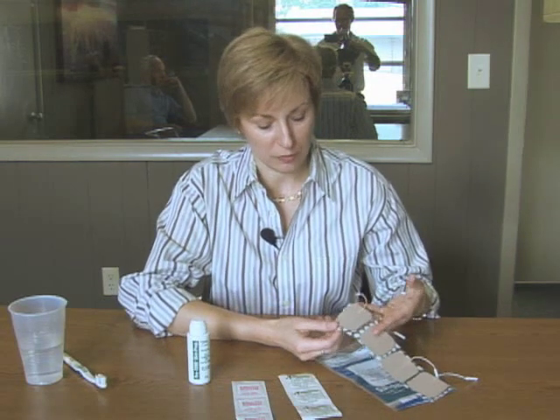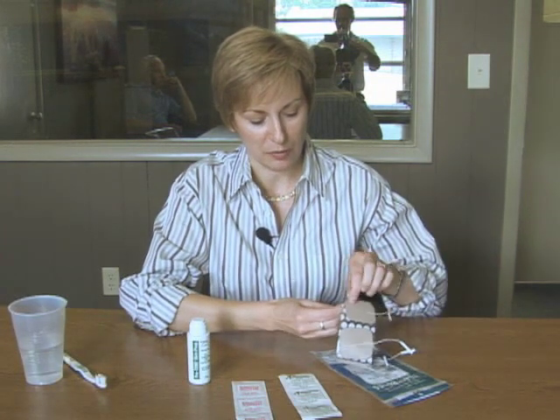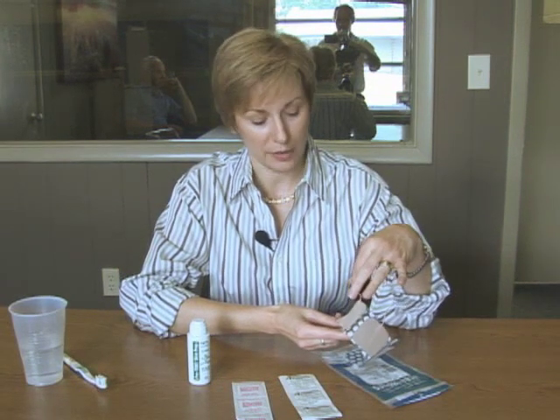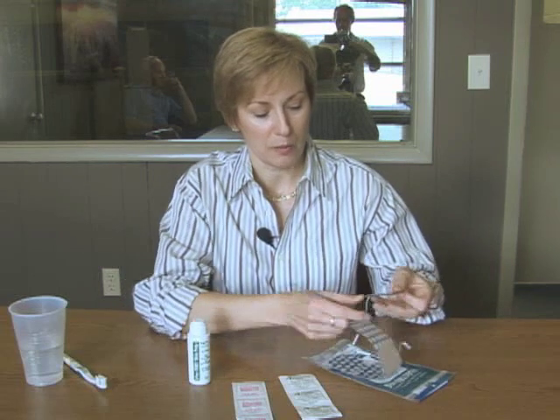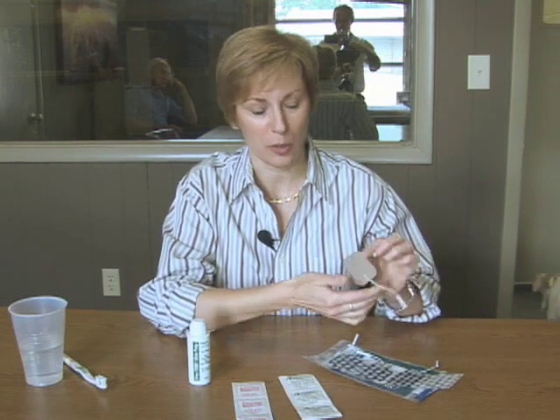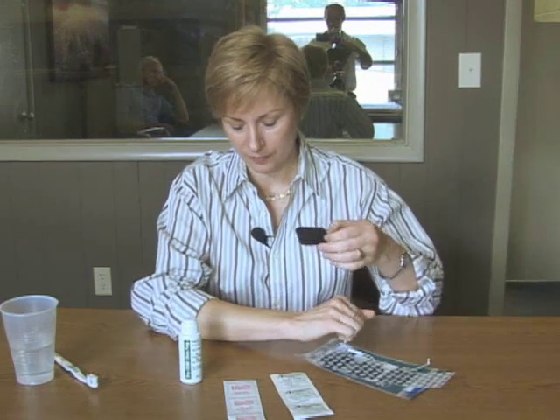Secondly, when you go to remove your electrodes, they come on a plastic strip, and when you go to take them off that plastic card, you want to peel them up from a corner. You never want to pull your electrodes off by the wire because you could actually pull the wire right out along with the area of the electrode metal part inside. So be careful handling them and peel them from that side.